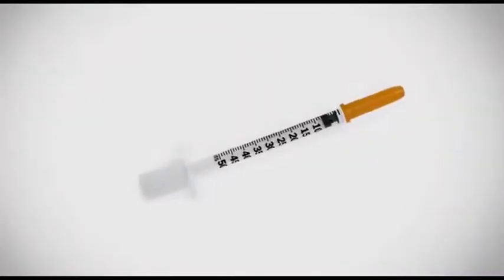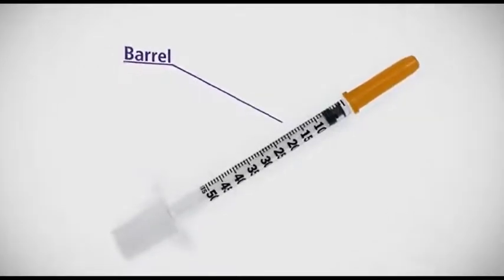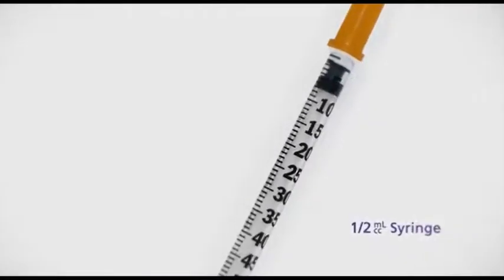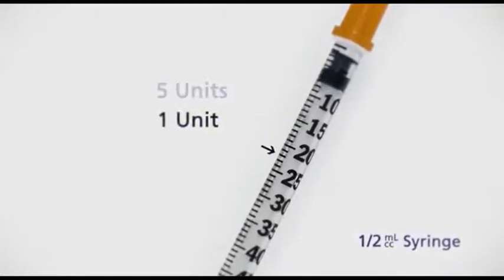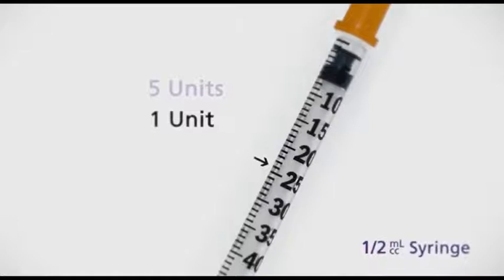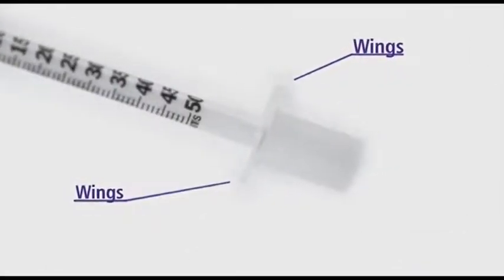Before I continue, I want to make sure you're familiar with the parts of the syringe. The largest part, called the barrel, has markings that are used to measure your insulin. A half milliliter barrel can hold up to 50 units. The long lines mark every 5 units, and the shorter lines in between indicate single units. The barrel has wings, or flanges, on the bottom to help you hold the syringe.